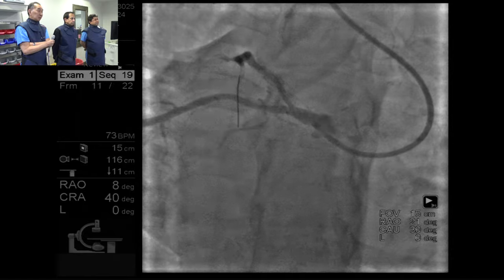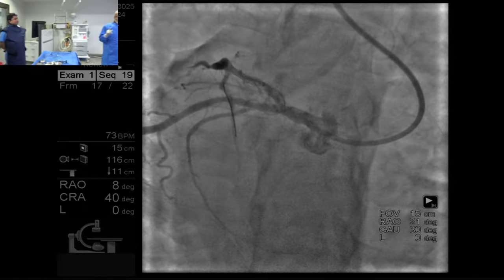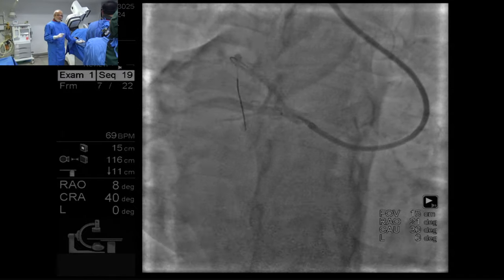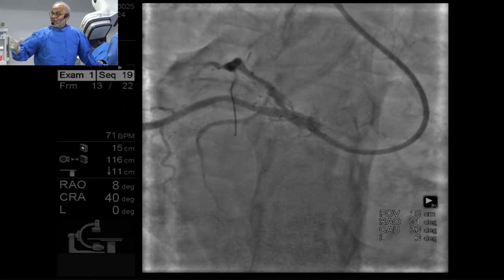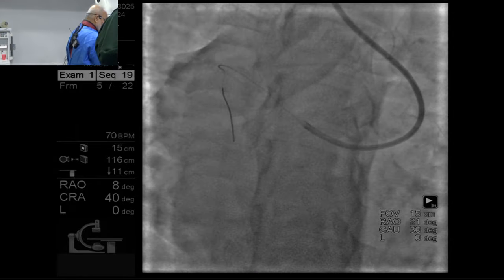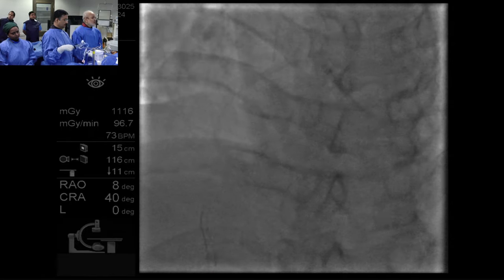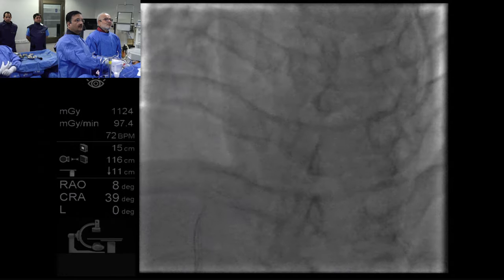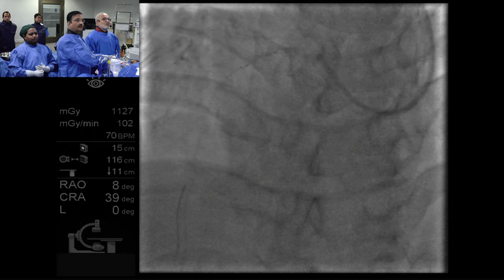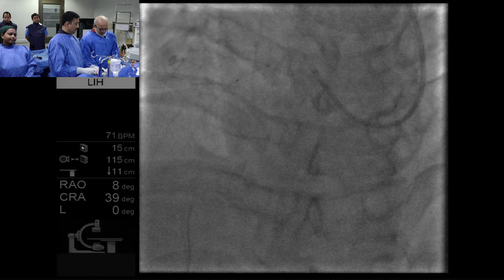Now next we have a good case of 120 pulses. We'll take that, and when the pulses are delivered, we will show you in vitro, keeping it in the water, how the pulses are delivered. I think during the course of these 2 days, at some point we will show you that. It looks like the support, despite the variation, is very, very good. Situs inversus and all that is not affecting it.